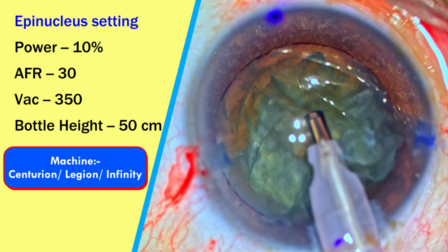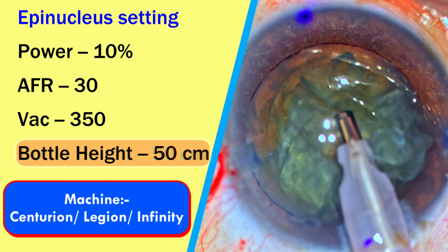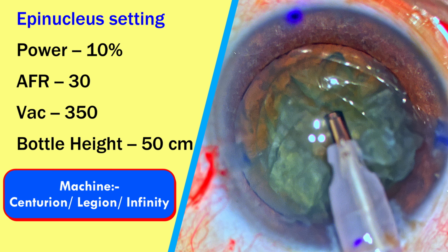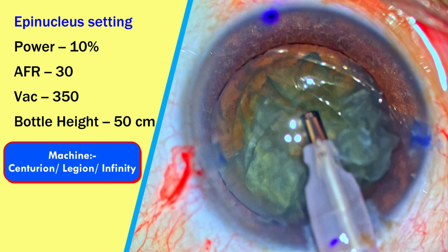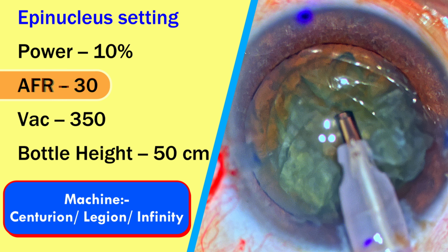I'll be working in a low pressure environment, meaning that the bottle height is going to be reduced. So I'm going to work here with the bottle height about 50 centimeters throughout the case at every step of the surgery, because this ensures that the chamber is not too deep. And because I'll be working with a lower bottle height, to prevent any antechamber from shallowing, I'm going to be reducing the AFR and the vacuum to compensate for it.